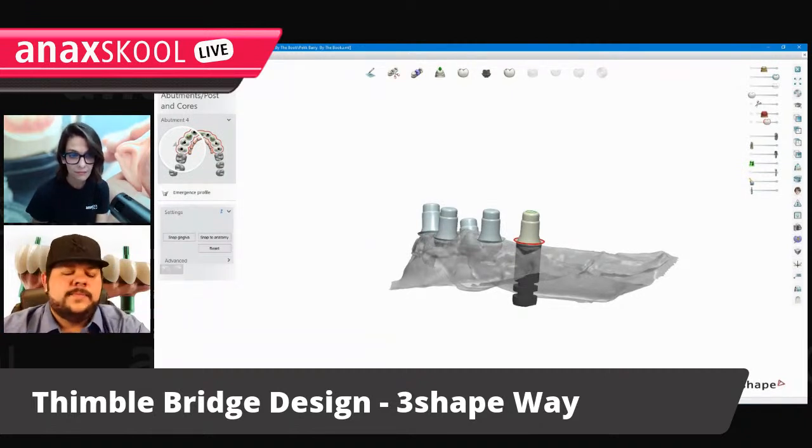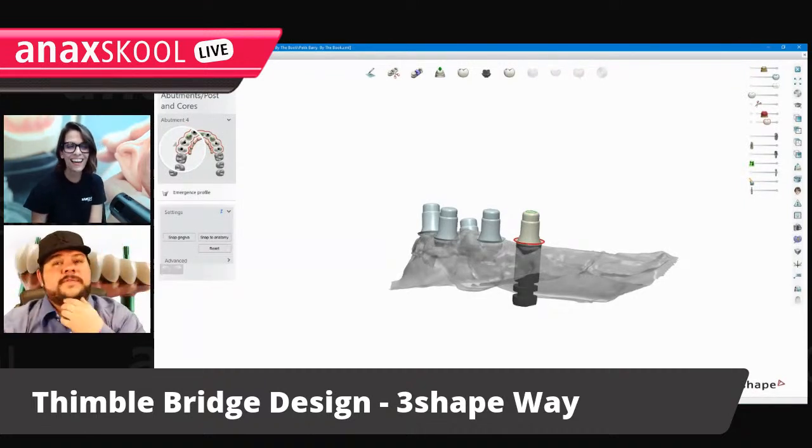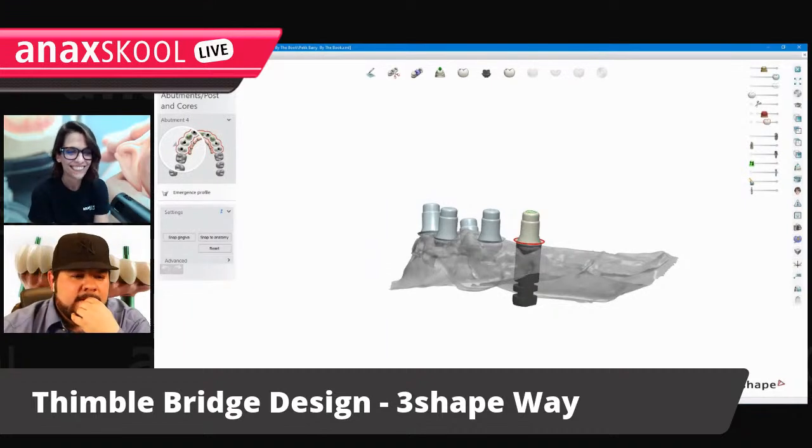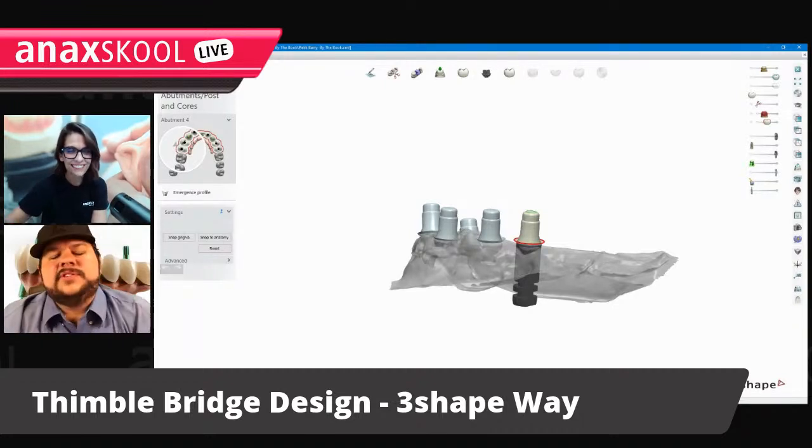If everything looks great, everything's set up perfectly, you can get a full upper diagnostic wax up done in an hour. But then you get cases where maybe the photos are terrible and you're not really sure where you're going to go with it because the patient's looking up into outer space during the photography, or you're not doing a full arch. Or you're doing a full arch, but you've got a lower, and you've got three occlusal planes, and you're just trying to manage a not so ideal situation the best you can. And the best way to do that is just spend some more time and a little TLC on it.